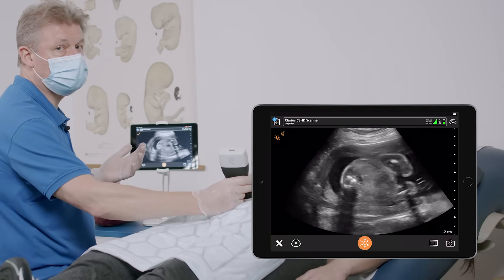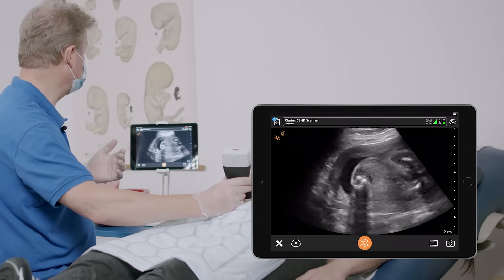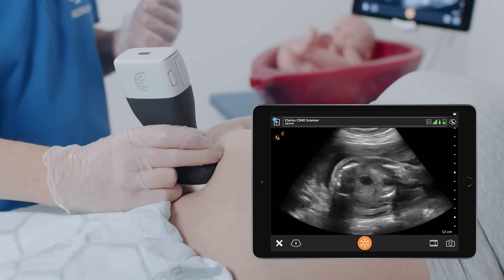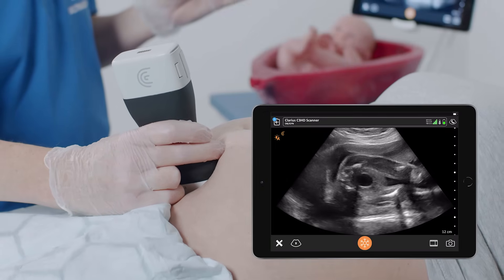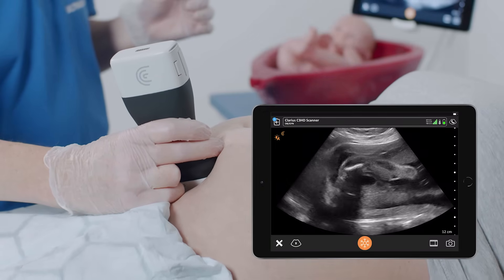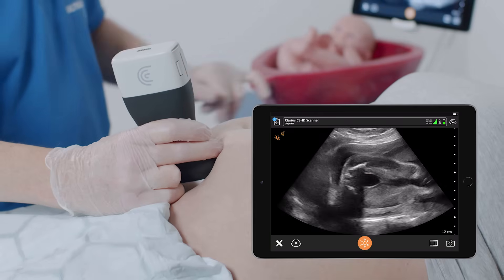For looking at the gender, we are looking for external genitalia. In this case you need to go to the lower part of the baby and identify the structures of the pelvis of the baby. Here you can see a round structure which is the bladder.